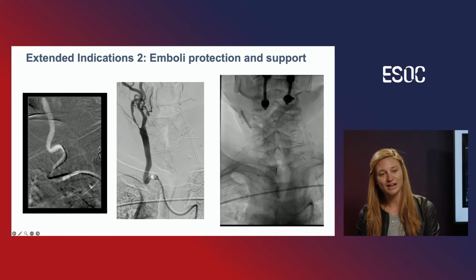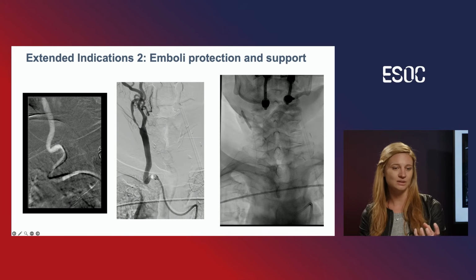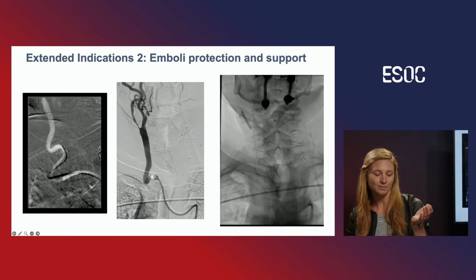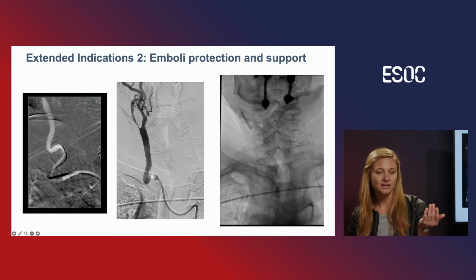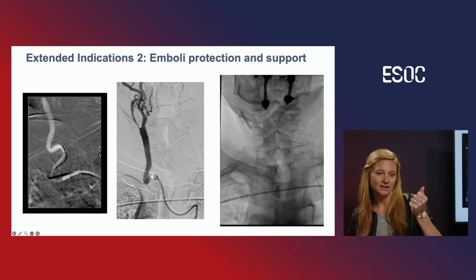So the patient came to us, and we used the balloon guiding first to generate stability. In the middle picture you see we inflated the balloon and then had it as an anchor for stability to get the PTA balloon up there through the tortuous vessels. And then we inflate the PTA balloon, deflate the balloon guiding balloon, and then we can move it up.